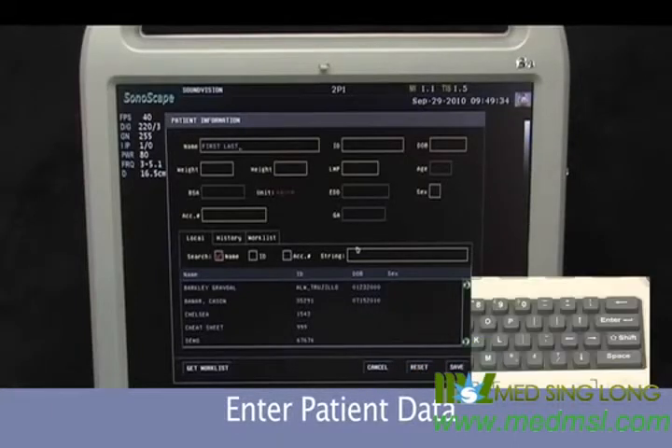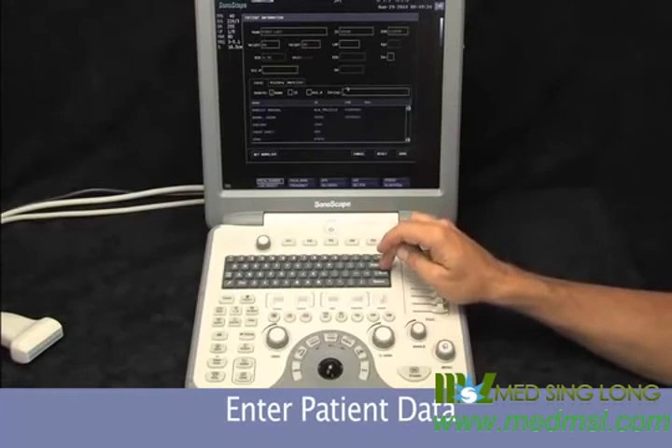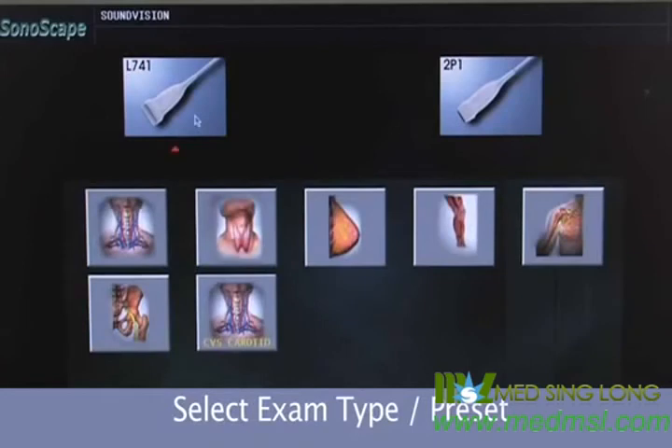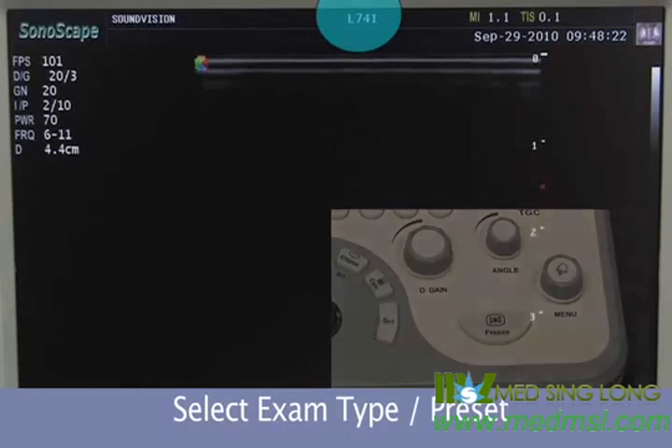We hit the enter button to move through the different fields — date of birth. You can also select a previous patient already in the system to continue on with their study. When we're ready to begin the exam, we simply select the save button. If you hover the trackball over the transducer, it gives you a selected set of presets already in the instrument, and you can create your own custom presets as well. For instance, if we're going to do a vascular exam, we hover over the vascular transducer, come down to carotid, and hit the set key. It automatically turns on the vascular transducer and is ready to go.